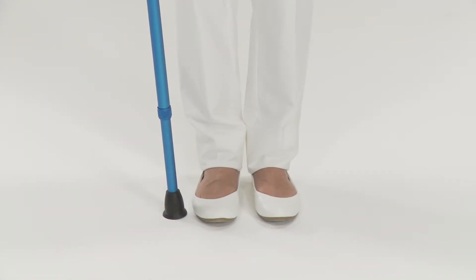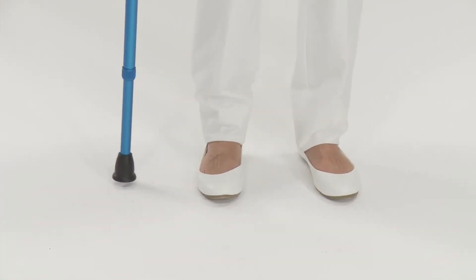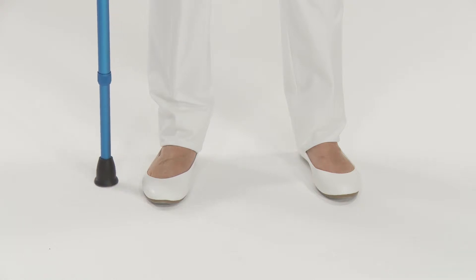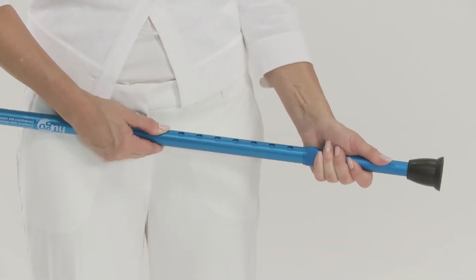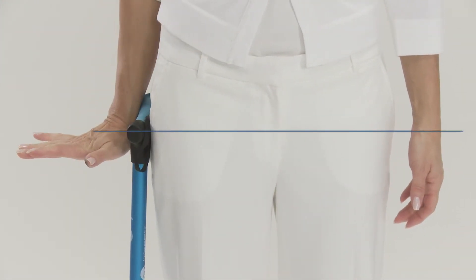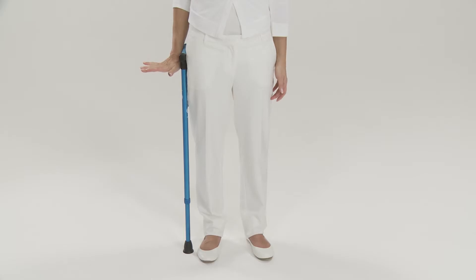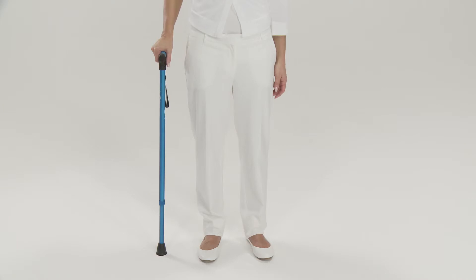First, put on comfortable shoes, then stand with your back straight, your feet slightly apart, and your arms hanging relaxed on either side of your body. Place the cane about 6 inches or 15 centimeters from the foot of the leg that isn't affected. Adjust the length of the cane so the handle is level with the crease in your wrist. Make sure the cane is always the right length for the shoes you're wearing and adjust it as needed.